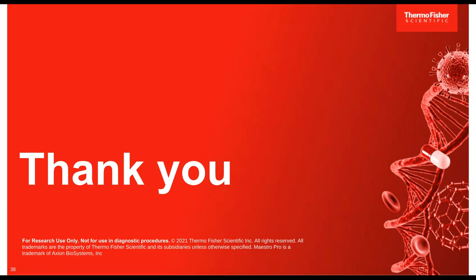So at least the ones that we've tested, each differentiation protocol, the morphology seems to be a little bit different during specification or during the initial differentiation process, whatever that may be. And this could have impacts on media penetration or just how well they take on the agitation rate and other things.